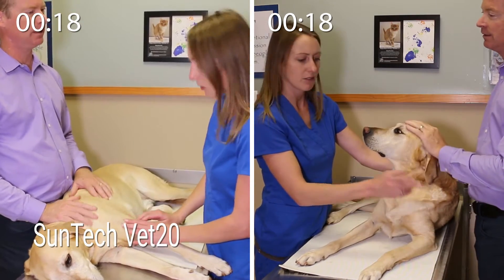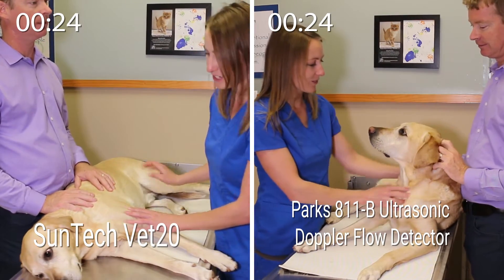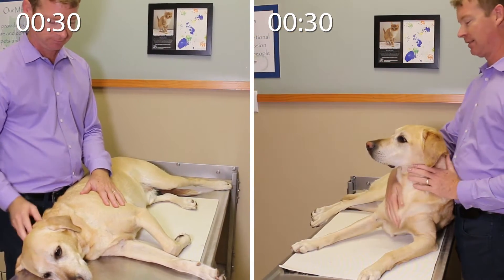The right side of the screen shows the measurement using a Parks 811-B ultrasonic Doppler flow detector. As the veterinary technician meets with Tucker's dad, she explains to him that she is going to check Tucker's blood pressure as part of a routine check-up.